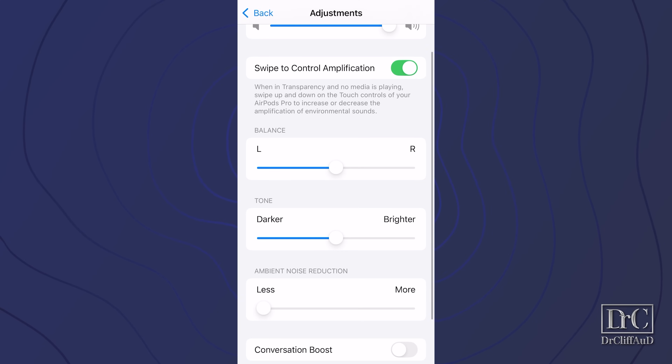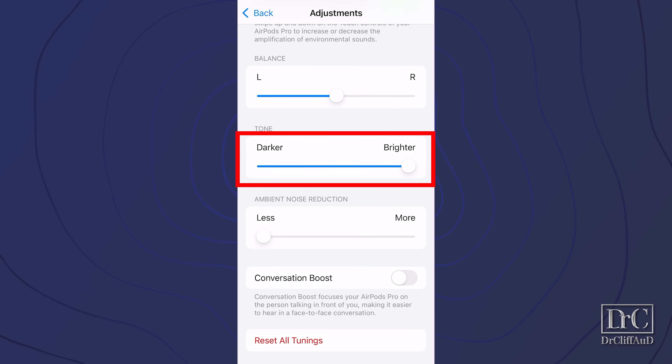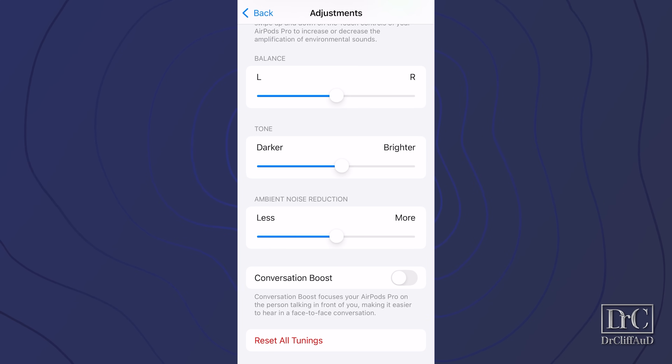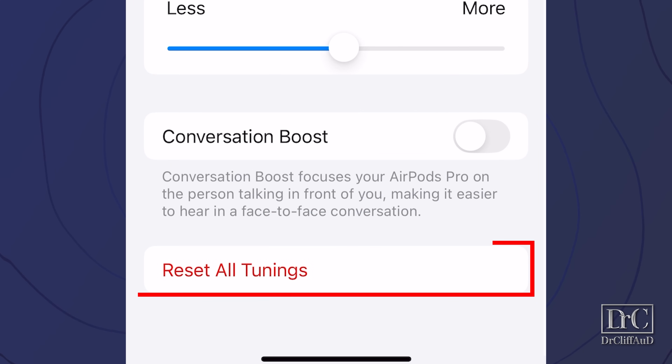To use the swipe feature, take your finger and swipe up on the stem of the AirPod to increase the volume level of your external sound. You can adjust the amplification balance between your left and right ears if you need more volume in one ear versus the other. You can adjust the tonal balance between brighter — which gives more high frequency sounds to make things sound sharper — or darker for more low frequency sounds that make things sound louder or more bassy. You can adjust ambient noise reduction to reduce steady state noises like fan noise, or allow more of those noises through. You can also toggle on conversation boost, which amplifies sounds coming from in front of you and reduces sounds from behind — typically helpful in a noisy environment like a restaurant. If you don't like the adjustments you've made, you can always reset all tunings.